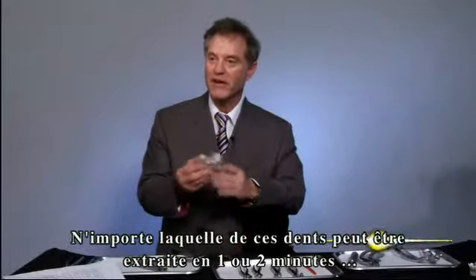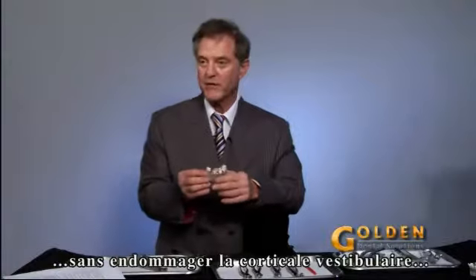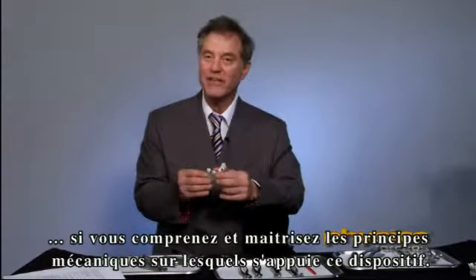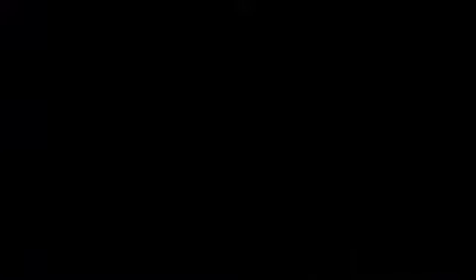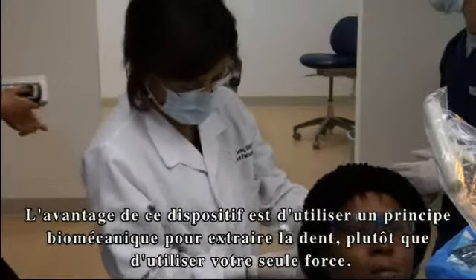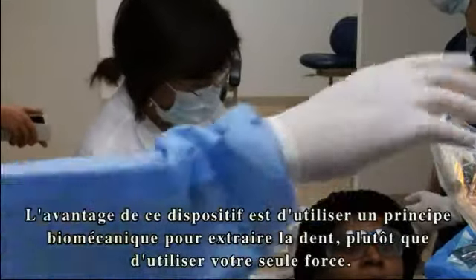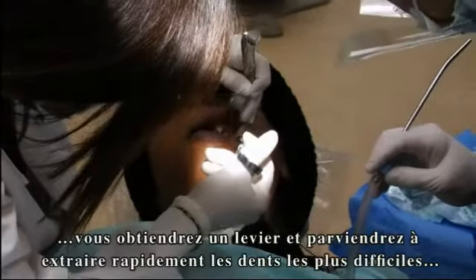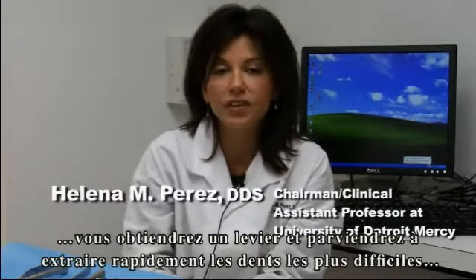Any extraction on any one of these teeth can be done in one to two minutes without breaking the buccal bone, if you understand the technique and the principles and the theory behind the instrument. Again, wrist movement — class one lever. The advantage of these instruments is using a biomechanical advantage to take the teeth out rather than just your strength. It doesn't matter how strong you are. If the instrument is used properly, you get leverage, and difficult extractions can be done very efficiently.